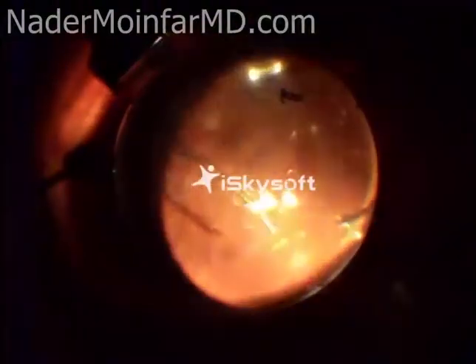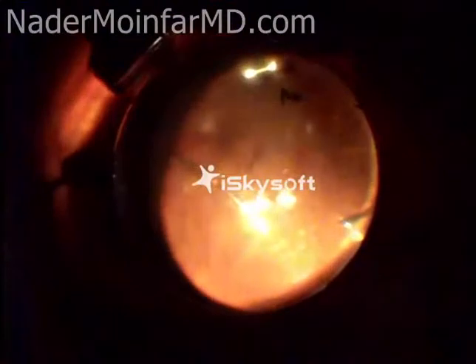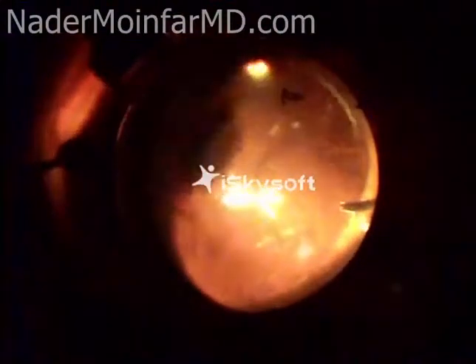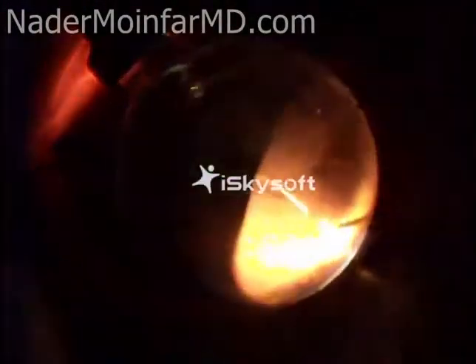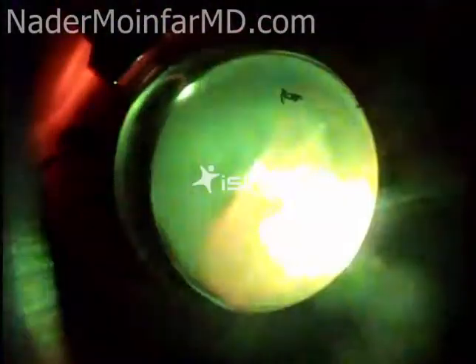This is called laser treatment of the retina, and each flashing green light is a laser spot. We try to basically treat as much of the retina as possible. Also during this case you will see something called scleral depression, which is when an assistant gently indents the periphery of the retina allowing for the surgeon to apply laser to the far retinal periphery.